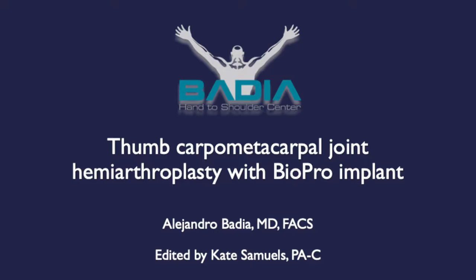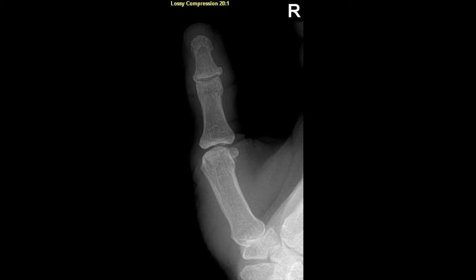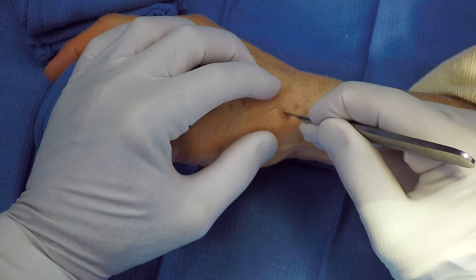The surgical technique for the thumb CMC joint hemiarthroplasty using a BioPro modular implant will be presented. The indications are generally older patients of moderate to low demand. X-rays here show marked joint space narrowing.